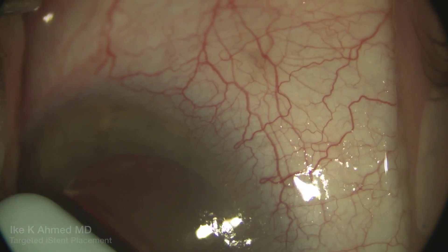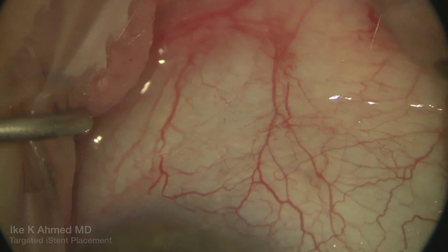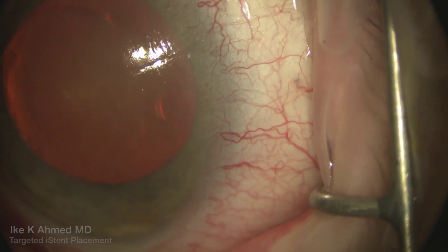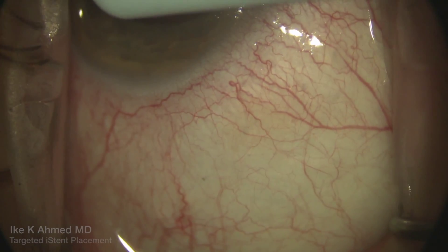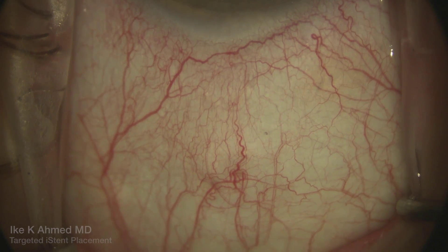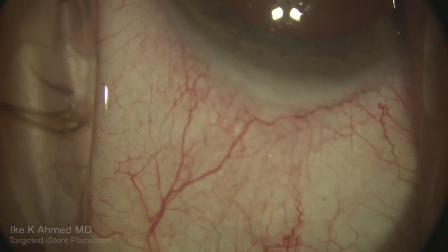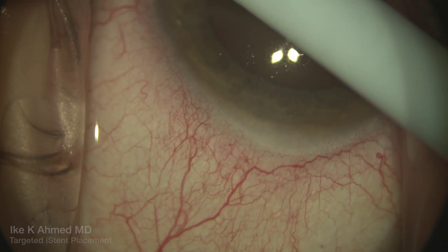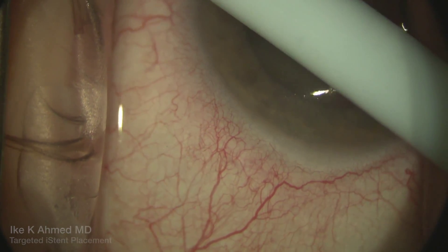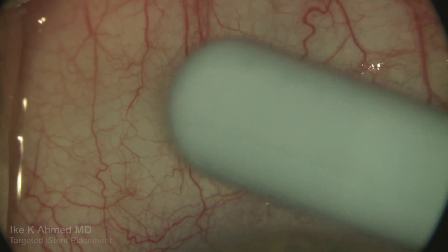This is seen as the aqueous vein merges into another episcleral vein and passes radially posteriorly. Looking temporally, the distribution of these veins is less so present in the temporal quadrant. There are some infratemporal, but the preponderance of these vessels is really more so in the nasal quadrant — infranasal and supranasal.